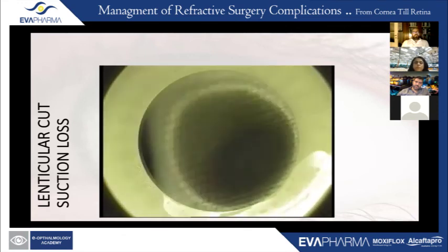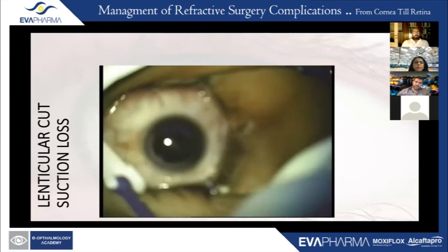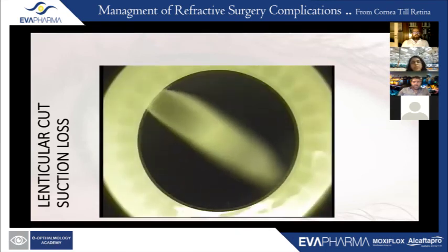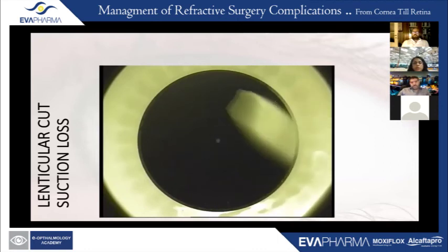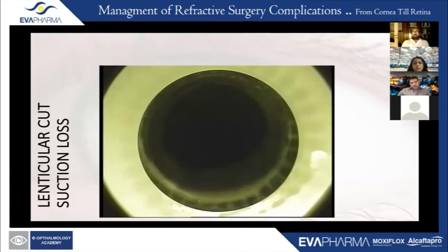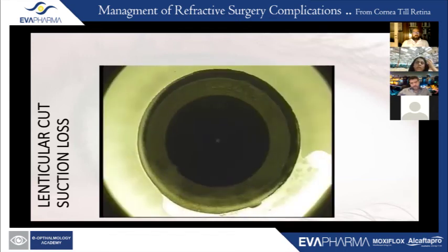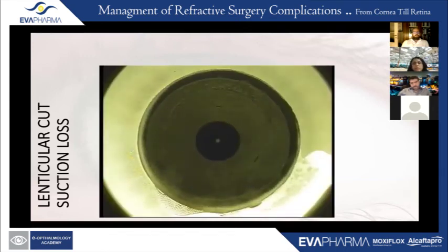So you can see what we're doing is just cleaning up that cone a bit, and one of the causes for suction loss can be excess fluid, which prevents that vacuum from building up. You can see we're removing all the fluid from the conjunctival sac as well as from the cone. Reapplanate, we've used the same cone, and go ahead and create a femtolasik flap with this.